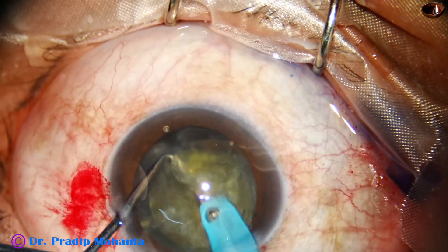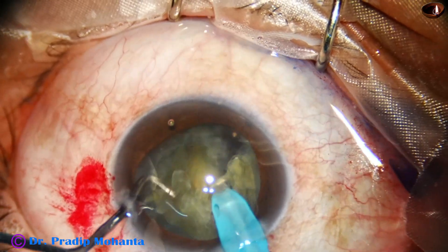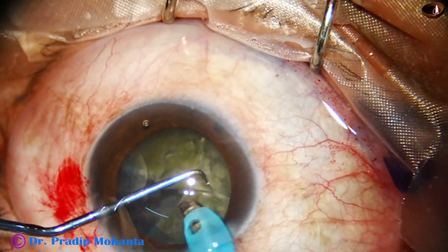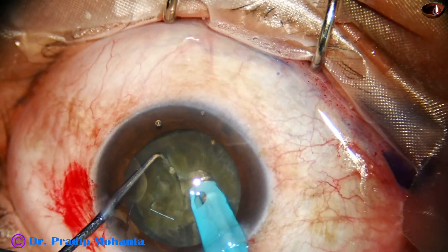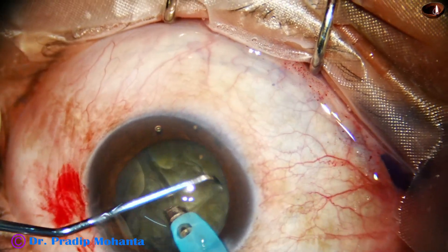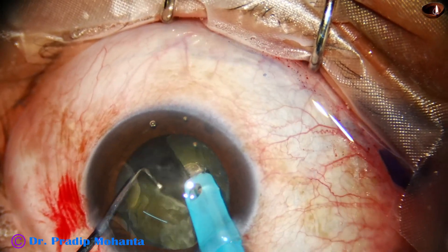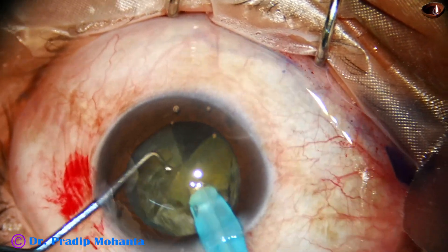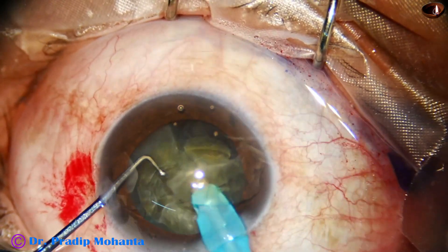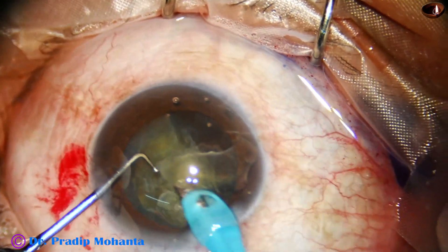I have to get a free nuclear fragment. This one is a free nuclear fragment. Other fragments are not actually free — they have some joining with the other pieces. So I have to hold one piece and manually separate the other piece. Hold this piece and manually separate it from the other one, and once it is separate, it comes easily. Bring all the pieces to the center of the anterior chamber.